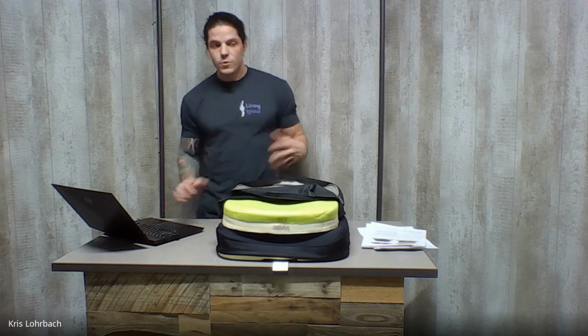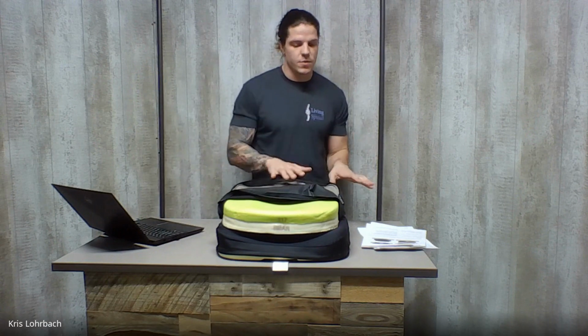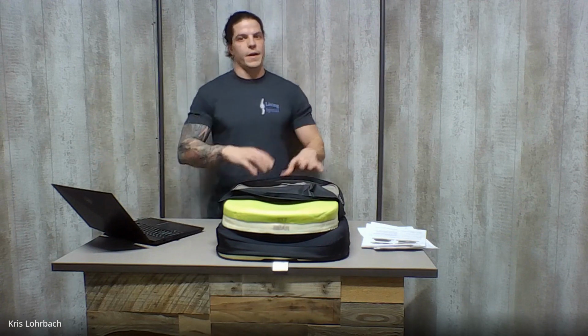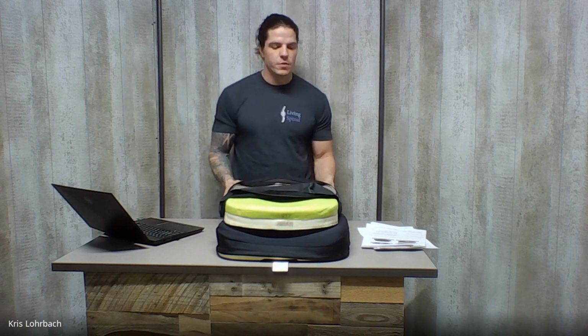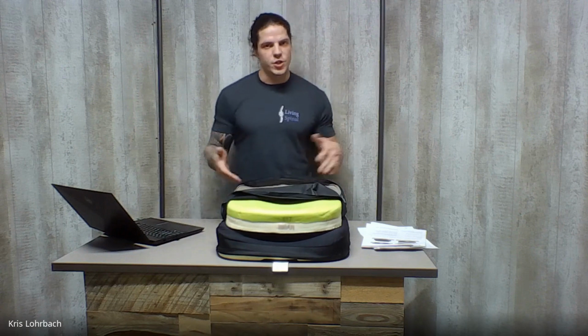And it includes basic inexpensive cushions, but there are also very advanced foam cushions. Not all foam cushions are cheap cushions. The big advantage to foam, and you'll see it in a lot of hybrid cushions, which we will talk about in a minute, is that foam provides great rigidity, and foam is also very easy to modify.